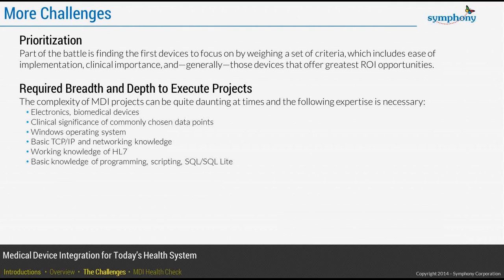You've got routers in various locations that feed the rooms these devices live in, so do you know the symptoms of a bad router, or a misconfigured router? Is that what's causing your problem versus a failure on the device side? Again, very helpful knowledge.